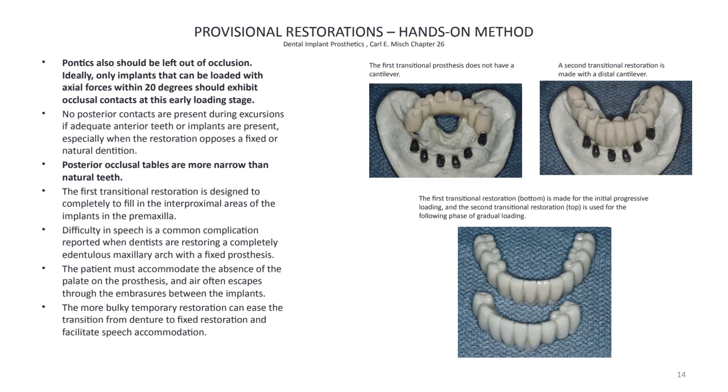And also during this time, when we do the fixed provisional restoration and it's inserted in the patient's mouth, it allows the patient for a period of time to get used to coming back from denture wearing to fixed. So it's going to take a little bit of time for the tongue and for the patient to get used to talking without the denture.